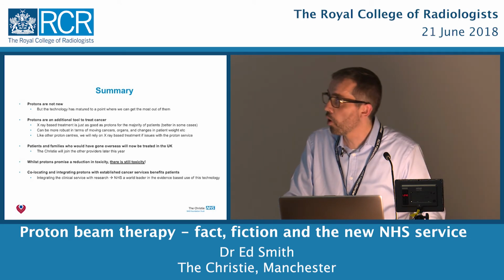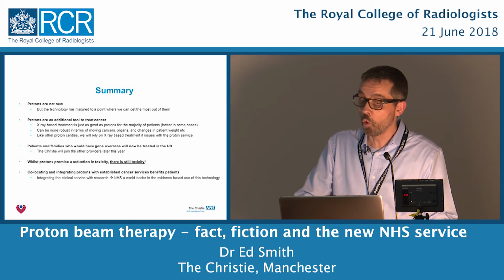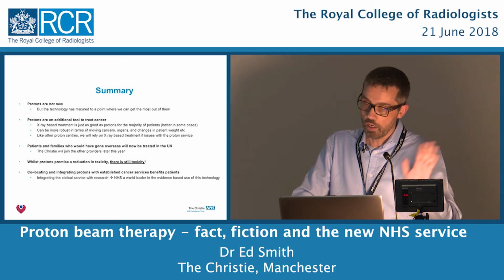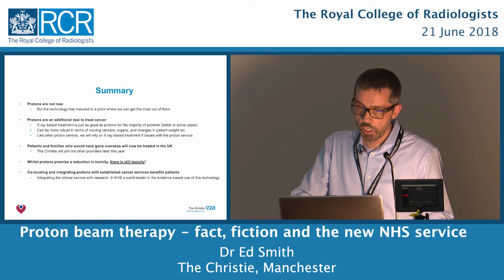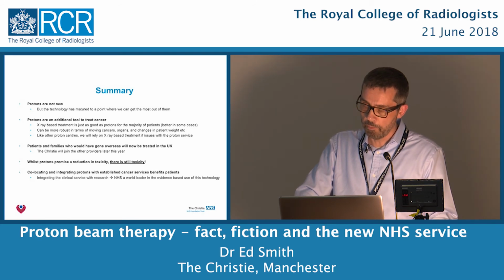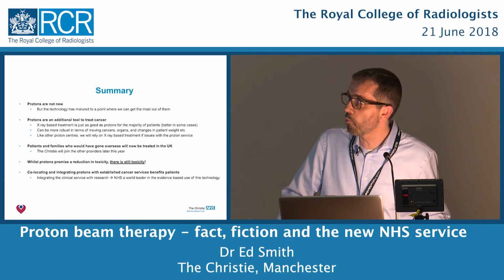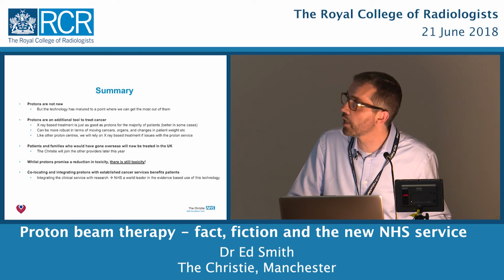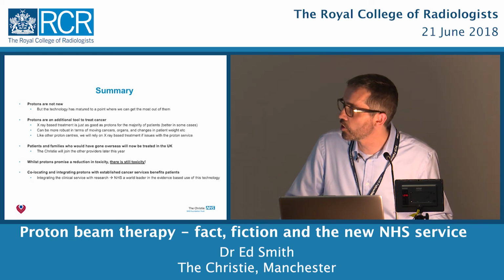And we make no apologies if we have issues with the centre and we're unable to treat with protons, which can happen. We will be using advanced X-ray approaches, as would any proton therapy centre around the world. There are some patients you may want to transfer to another proton centre, but they are rare. Patients and families who would have gone overseas will now be treated in the UK, a lot more convenient, and of course, as I said before, access to those who previously couldn't have travelled, I think, is a big plus, having a service in the UK. And we as a centre are very proud to join that service later on in the year.